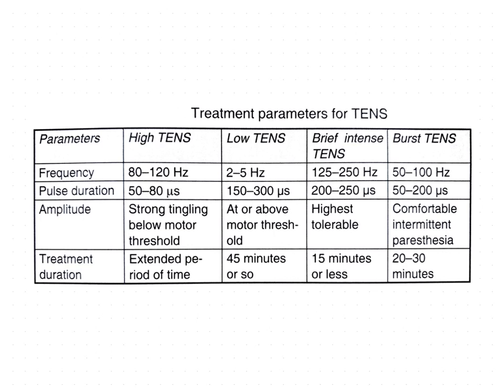If you see the techniques of application of TENS, the first thing, as for every electrical equipment in therapy, is that we have to prepare the patient, and then electrode placement of the TENS for the patient, and the next one is the selection of treatment parameters. Yes, now we are at that position, that is treatment parameters for TENS.